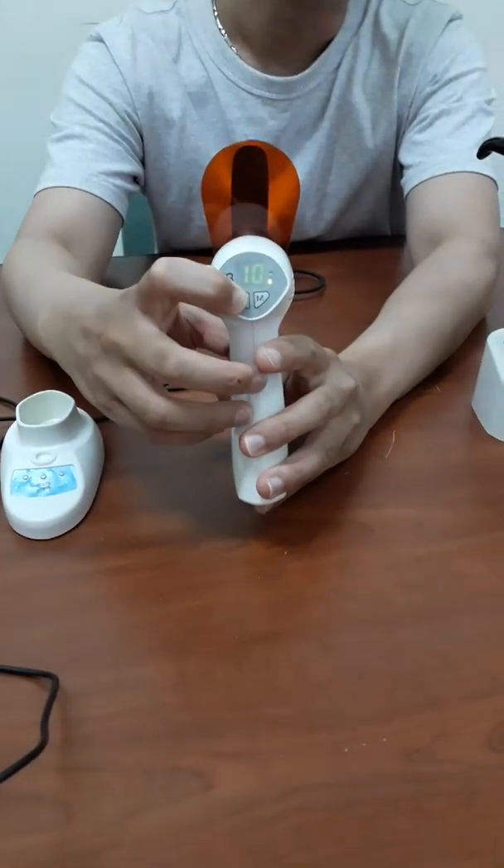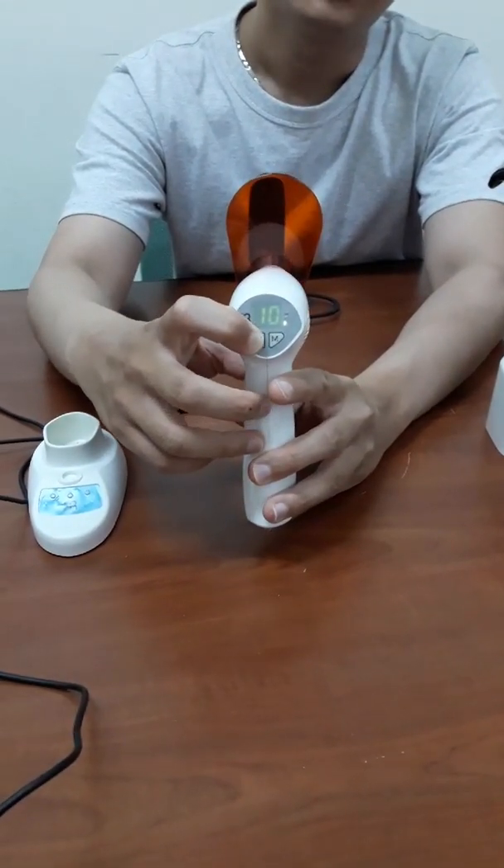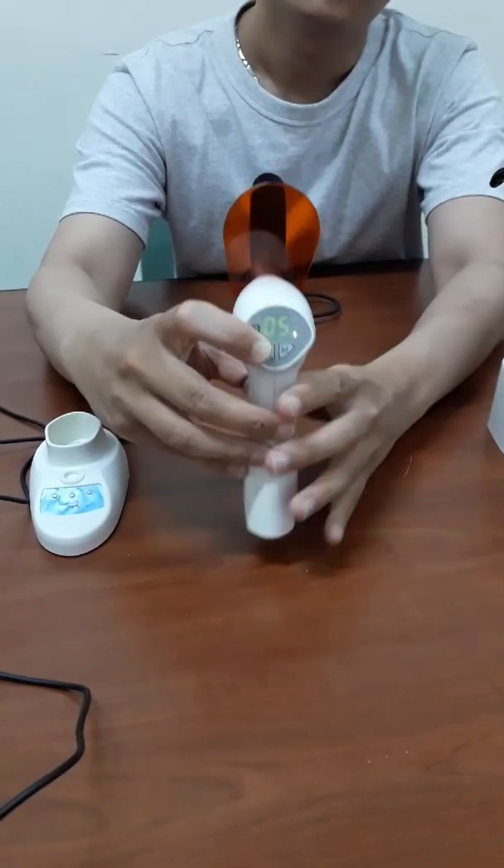We have four modes to choose. We have high and low intensity, and the round up, and the circle.